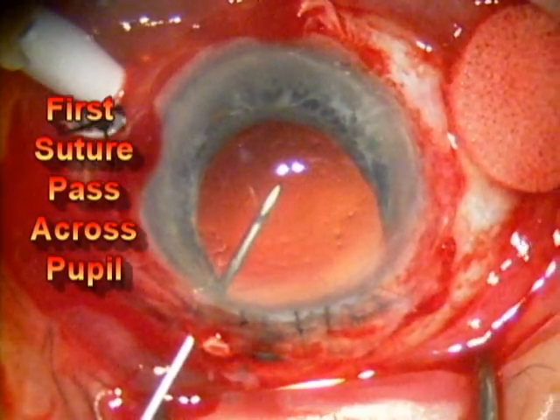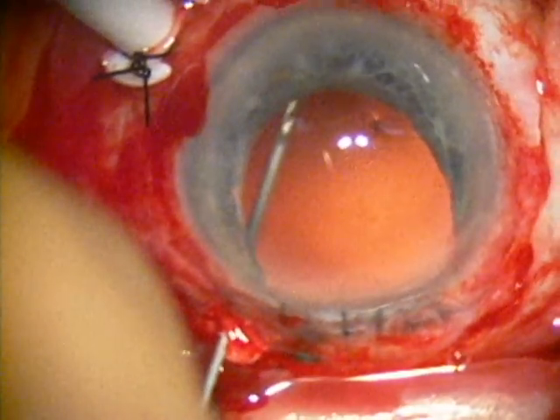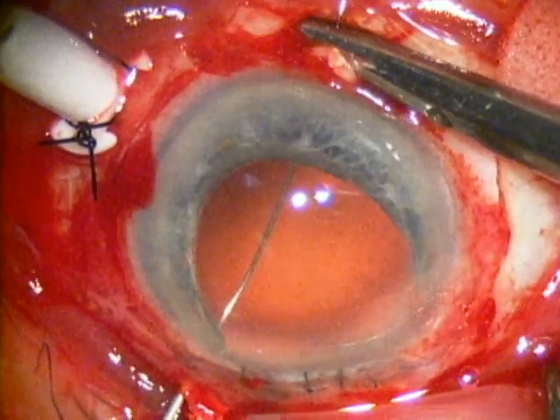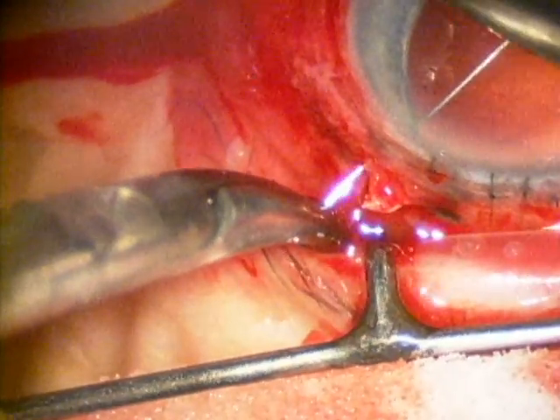On the lower part of the screen, a 27 gauge needle is inserted and then here on the top of the screen, the suture needle is inserted into the eye. The needle is guided across the pupil with the 27 gauge needle and a fair amount of pressure is placed on the globe so the tip of the needle comes out the other side of the eye and can be grasped.